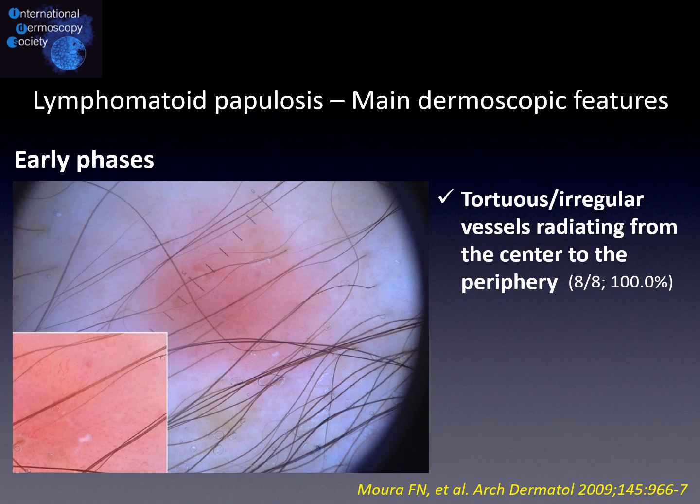Let's move to lymphomatoid papulosis. It is important to underline that the dermoscopic picture of this condition remarkably varies according to the disease stage. On the basis of the larger study on the topic, the main dermoscopic clue in early phases is represented by tortuous irregular vessels radiating from the center to the periphery, even though it is not uncommon to come across dotted vessels distributed in a diffuse or sparse way.